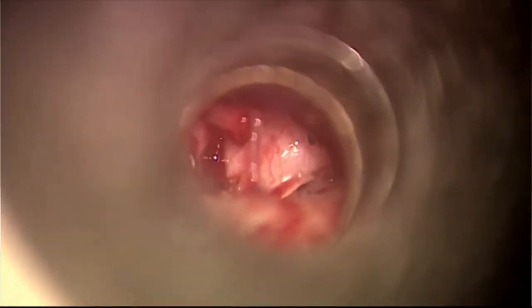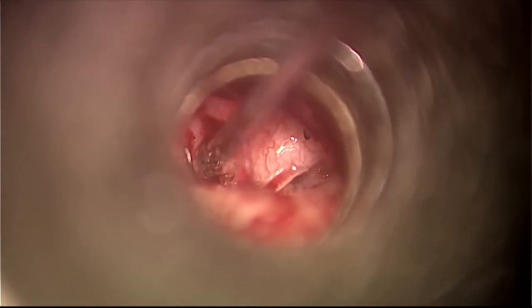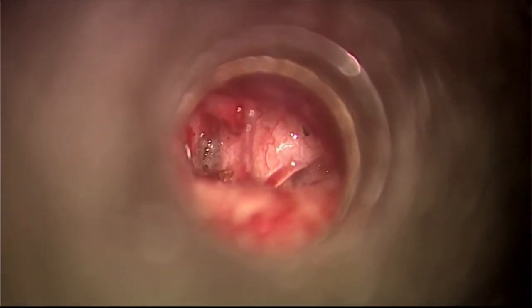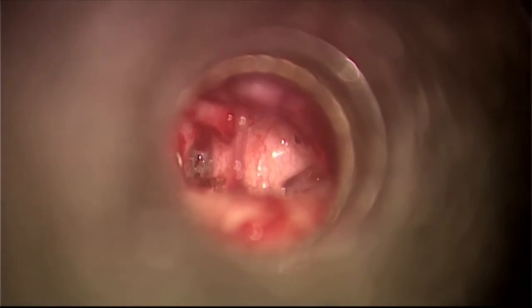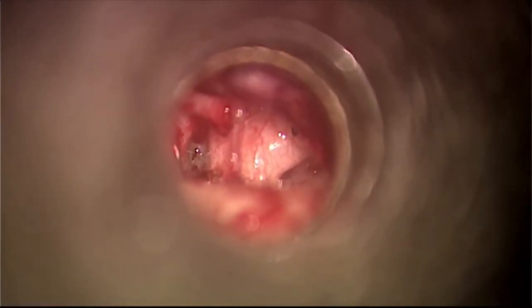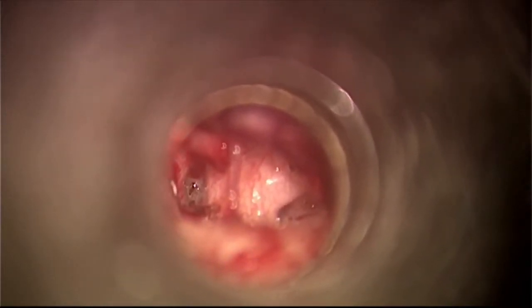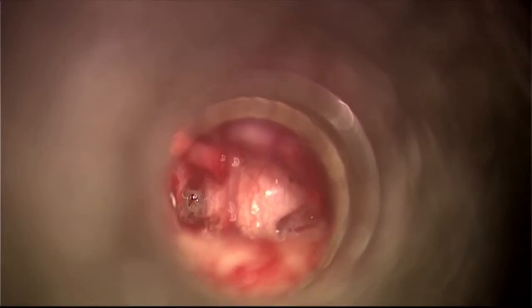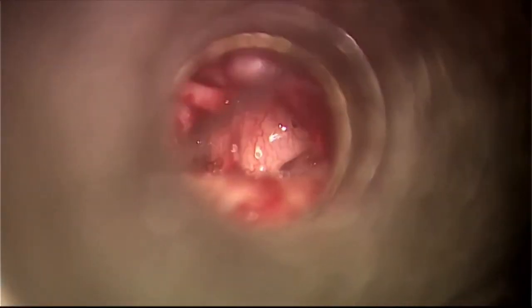See this? Perfect. Forceps. Now I will remove this and see my footplate. See that? Already small fenestra is made or what? No, not finished. It was just a beam. When I was firing at the posterior crus, a bubble was made in the mucosa. Since it was far off from that, the energy was not going to that level.